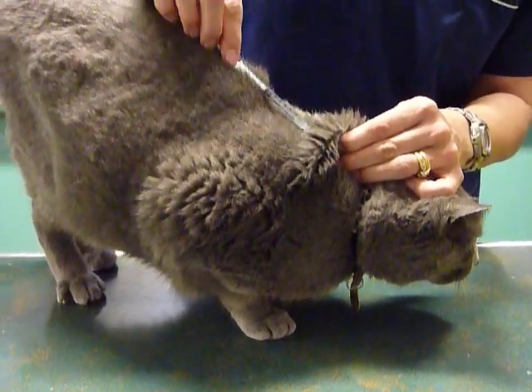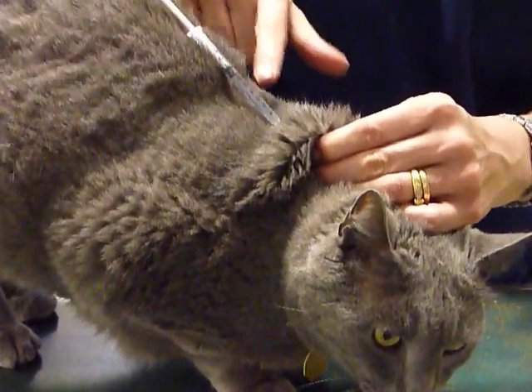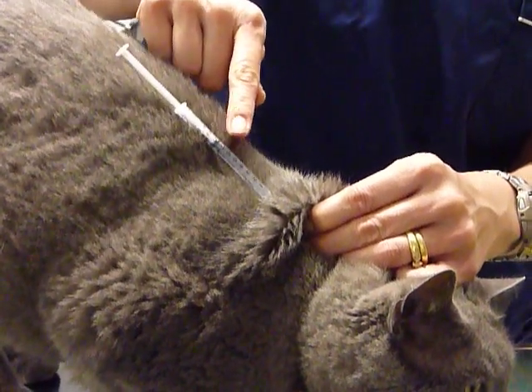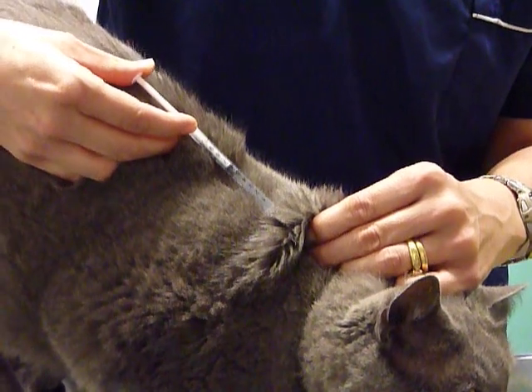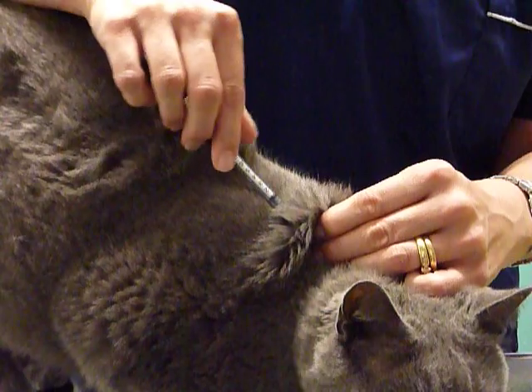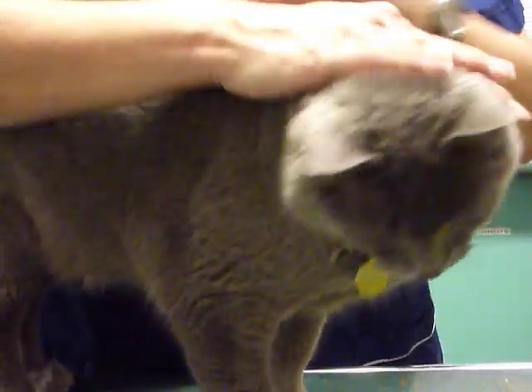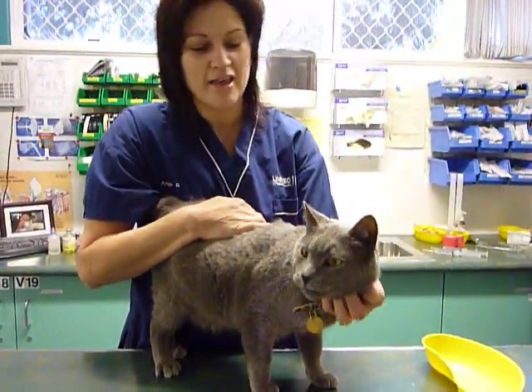Draw back on the plunger — this ensures that you're in the correct place, and you want the plunger to have resistance. Then you can simply inject the product that you're using. Remove the needle and give a nice gentle pat on the back of the neck to ensure the animal is happy.